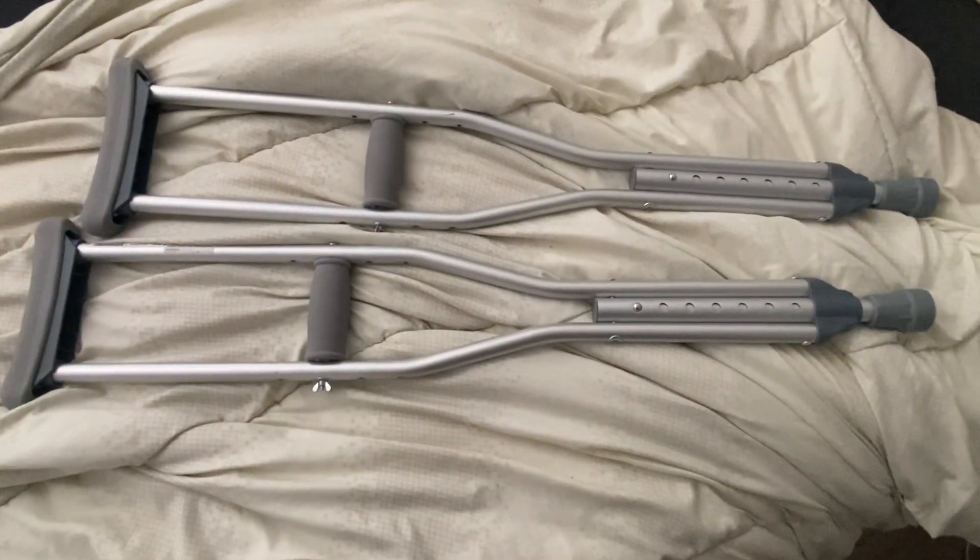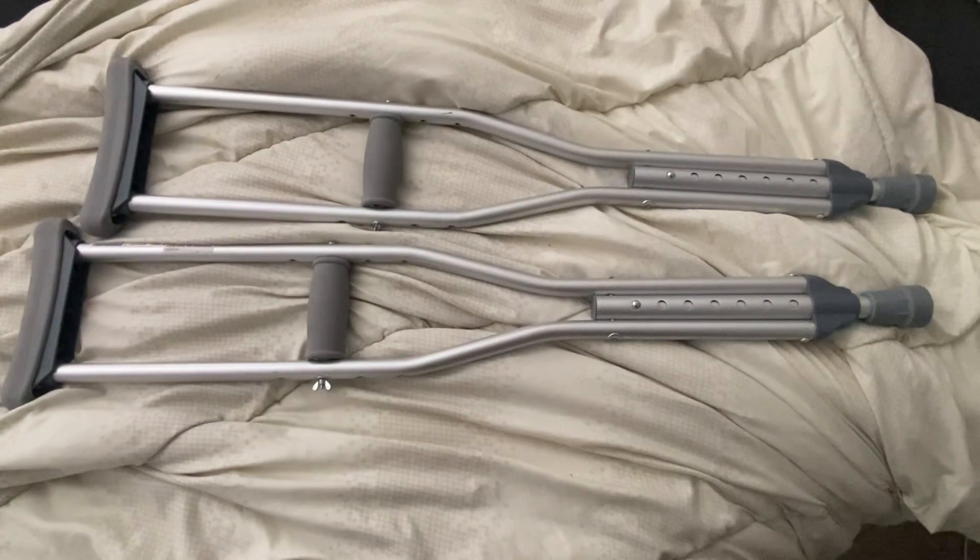Hi, my name is Crystal and this is a review of the PCP Aluminum Child crutches.